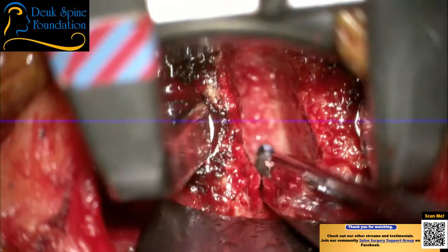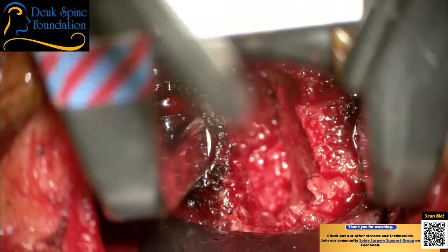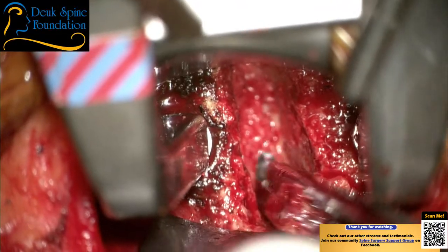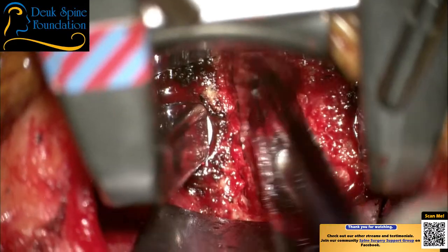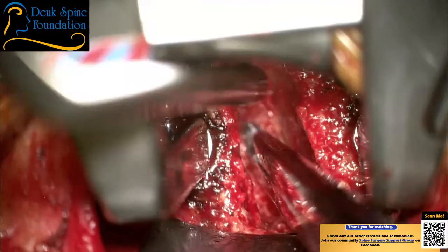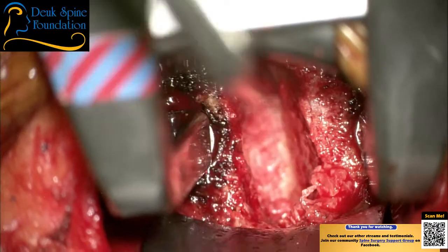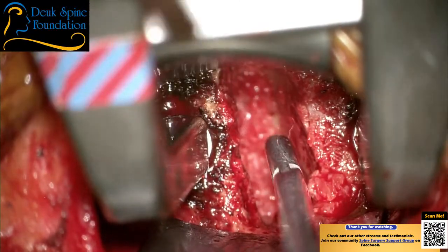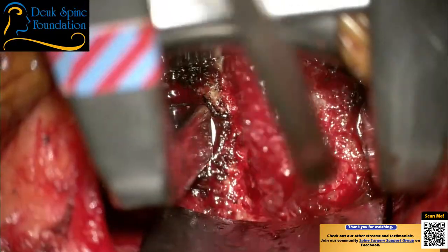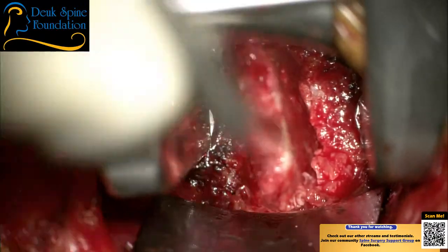Now imagine this would be impossible to do without the microscope. Is it a 2? Yes, sir. Let me see. Wipe. All right, suck please. Keep sucking for me. I've got to see all the little areas down here, and that requires sucking. All right, let me have a pituitary. That's a piece of calcified herniation right there. Let me have a curette too. A thinner sucker. What is that, a 9? He needs like a 7. I said curette 2, not Kerrison 2.